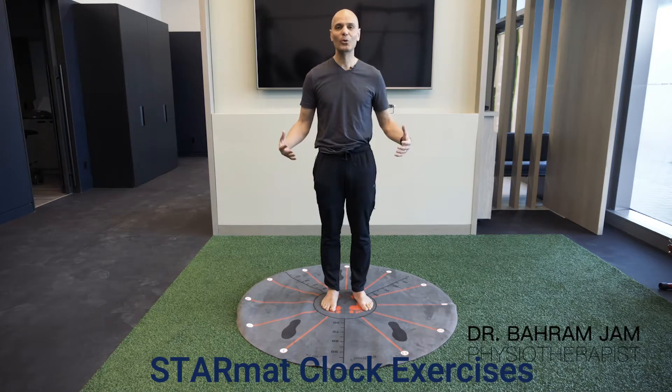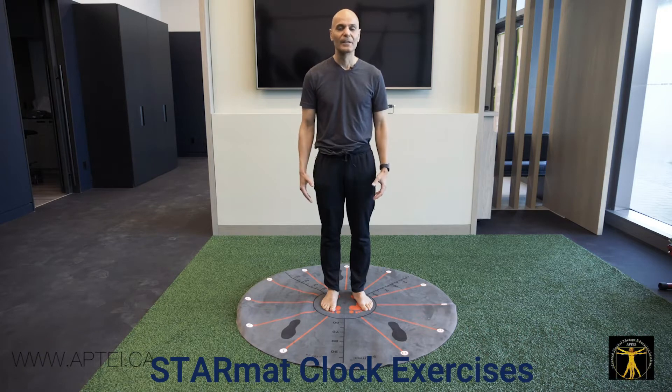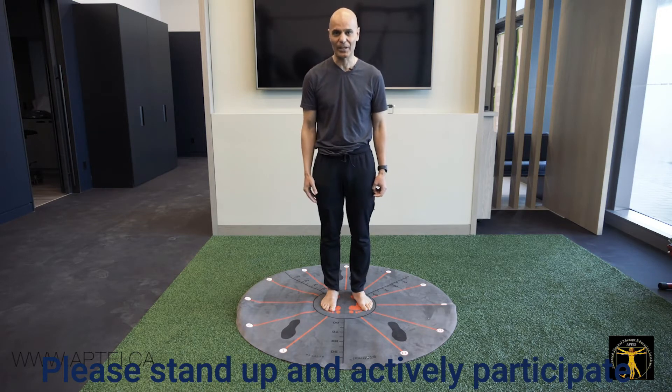The StarMat is one of the most clinically used pieces of equipment in my clinic. In the past 8 years that it's been distributed across Canada and internationally, I've had extremely positive feedback on it.